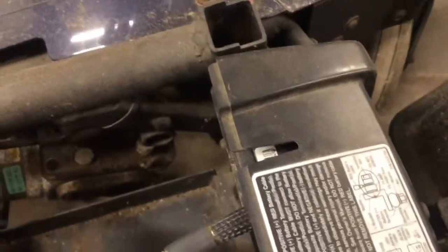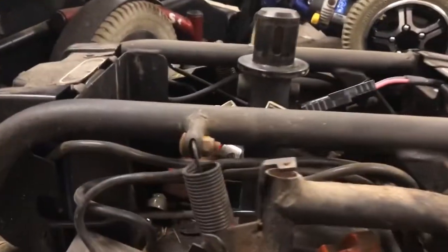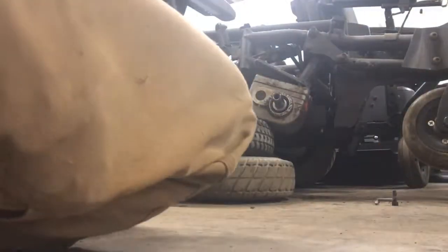So I guess, let me see here. I guess we'll just do that for your safety. Okay. So basically I've still got this motor jacked up. So let me set this motor down and I'll turn this chair around. I could unplug it right now, but you won't know which piece to put down, so let me go ahead and lower this.